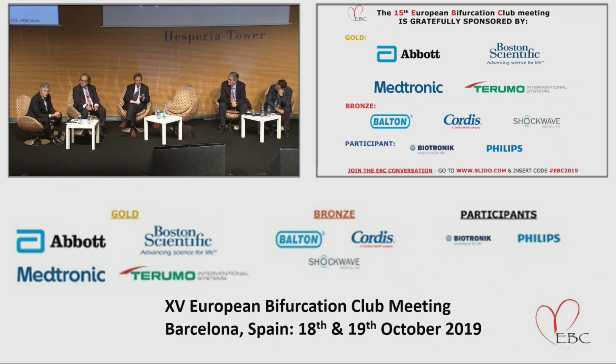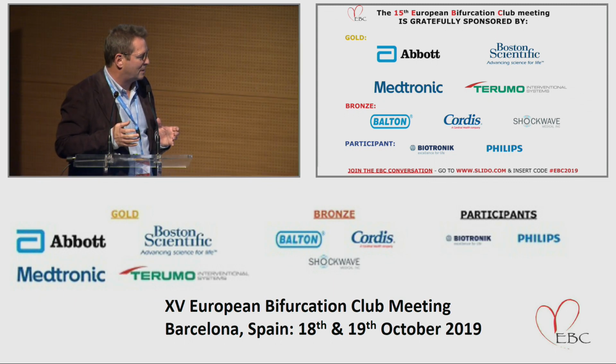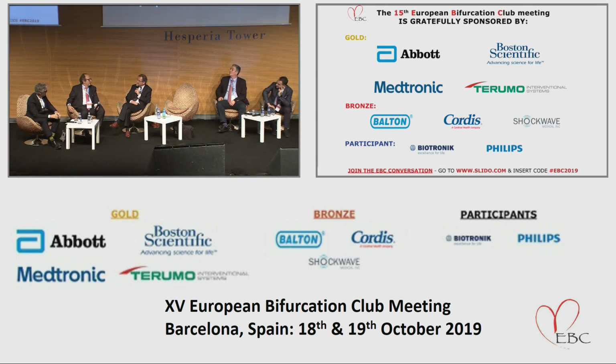Oh, but that's actually very interesting. But I wonder why you would use a Megatron for the cross, because I would like to have it in the large diameter. But if you cross it towards the circumflex, why use a Megatron? It doesn't really make sense. Yeah, because of calcification, and there was a recoil, and that's why after kissing, it was needed to perform stenting.